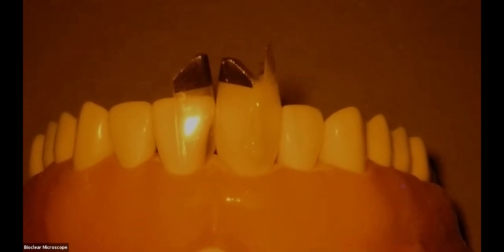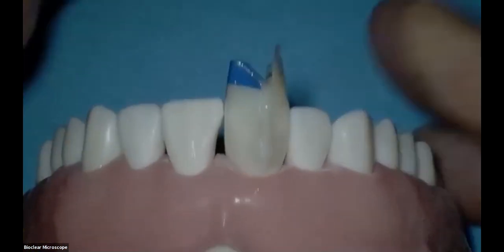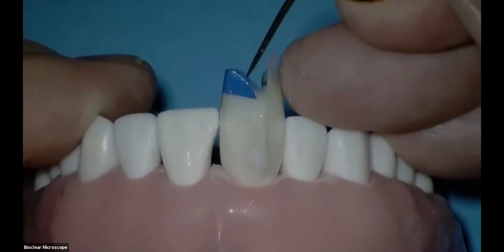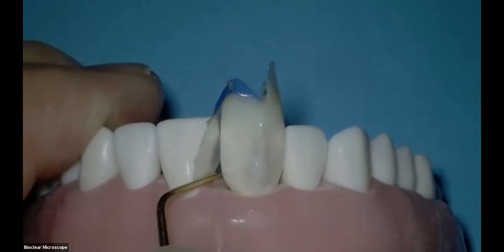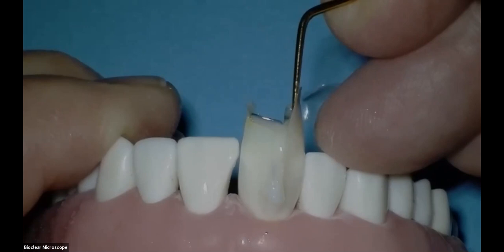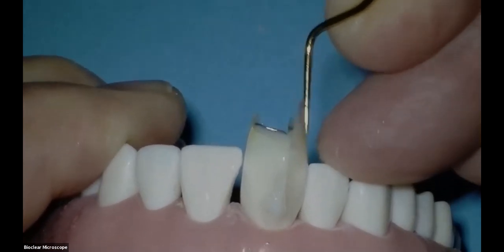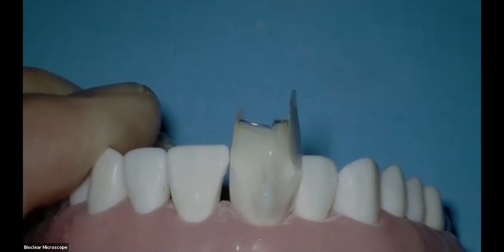All right, so now we're going to go ahead and take the matrices off. And it's very important to take the Explorer and reach under the contact. This is the Clark Explorer. It's super helpful. This is monolithic composite. It has about the same compressive strength as Emax Press. And let me go ahead and have the hemostat.